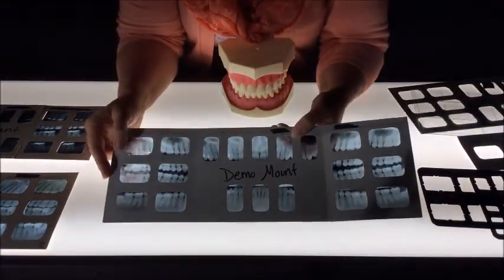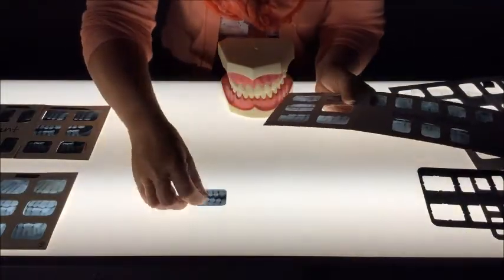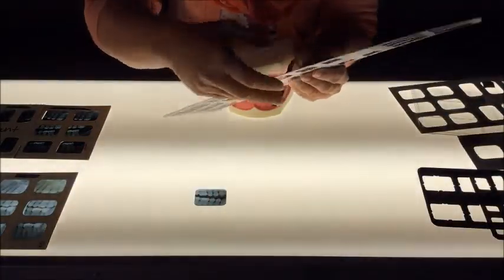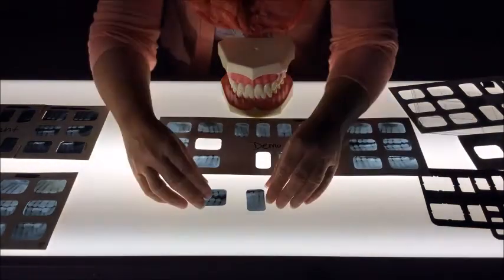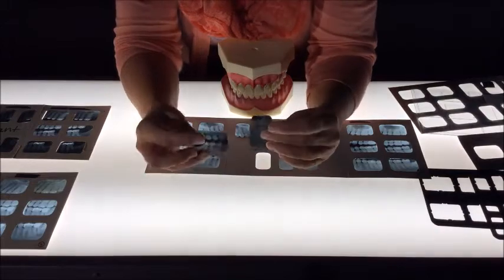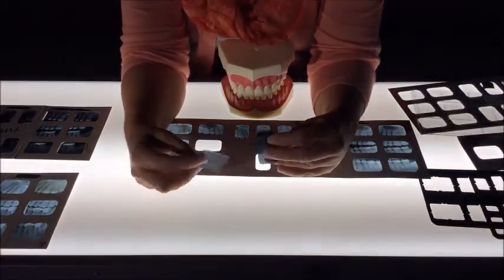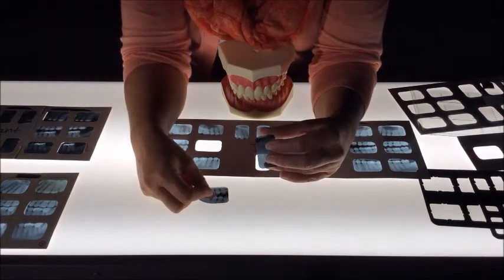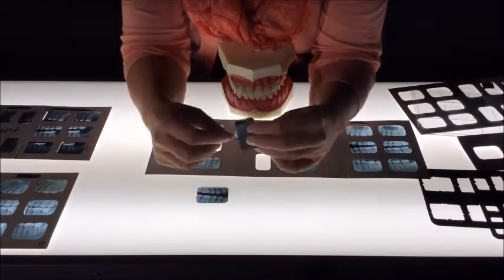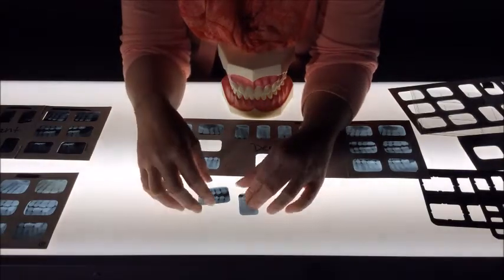The next part that we want to look at whenever we look at a film, whether it's a larger film or smaller size films, because films come in different sizes. Some of them come in a size 0. This is a size 1. This is a size 2, and you'll learn later on there's larger sizes. Generally, it would matter based on the patient's size of their anatomy. A size 1 film fits better for a smaller mouth than a size 2 film.